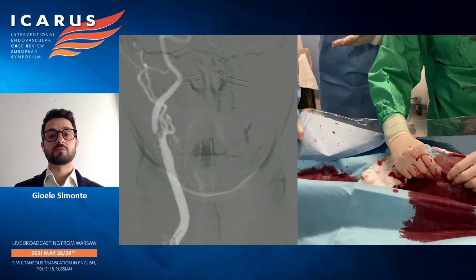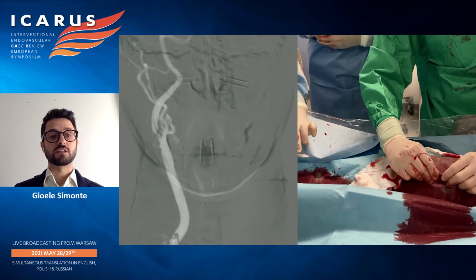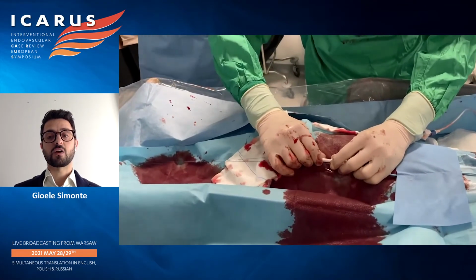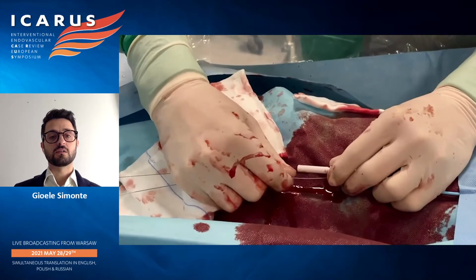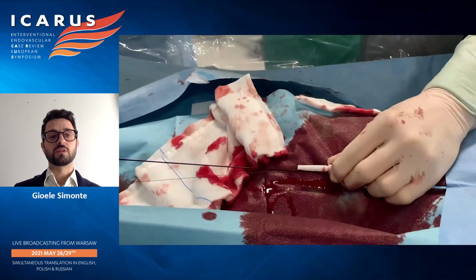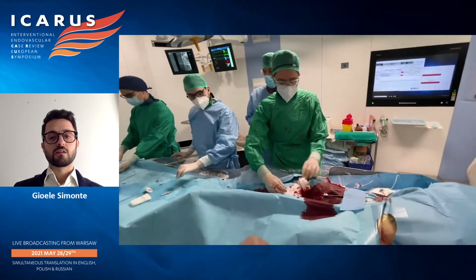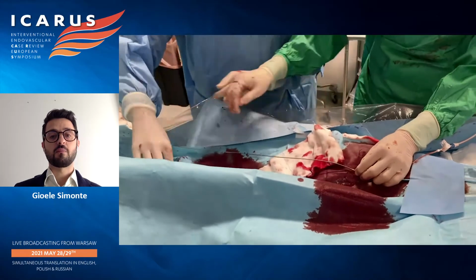A distal filter is then prepared and advanced. To obtain some directionability, we prepare the tip aiming to gain a smooth crossing of the stenosis. The lesion is then crossed using the roadmap, and the filter is released in a healthy internal carotid artery distal segment. You see here, holding firm the position of the distal filter, we set it free by pulling back the delivery system. The delivery system is then removed, and we are finally able to advance our micromesh device.